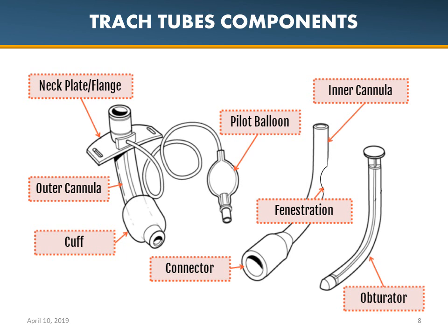Let's talk about trach tubes and their different components. We have a neck flange and plate, where you can find the inner diameter, outer diameter, sizes, whether they're fenestrated, and if there's an inner lumen — like a fact sheet right on it. We also have the outer cannula, which is predominantly always going to be in place. This one happens to be cuffed, as indicated by the pilot balloon. The connector is on the end of the inner cannula and is the 15mm adapter. This tube happens to be fenestrated, and here is the obturator, which helps facilitate insertion.